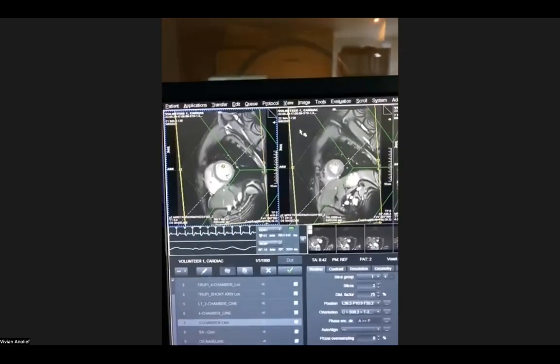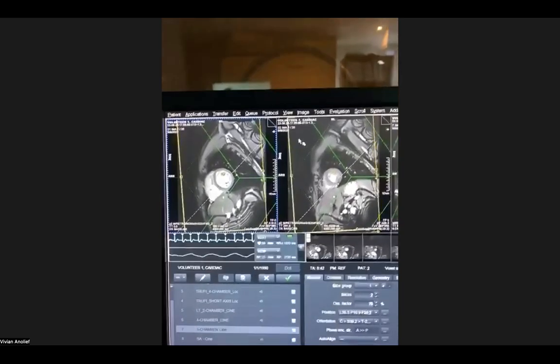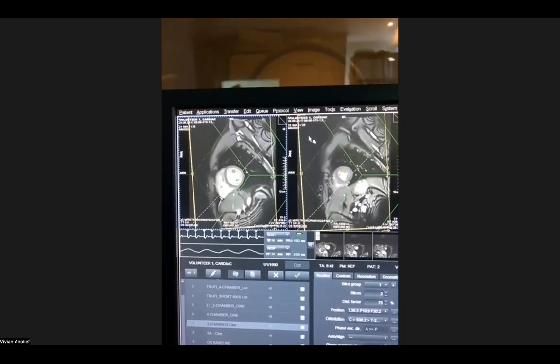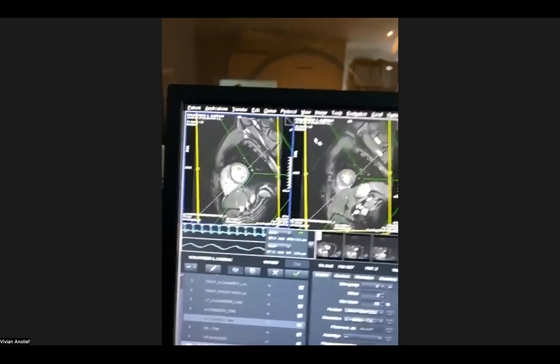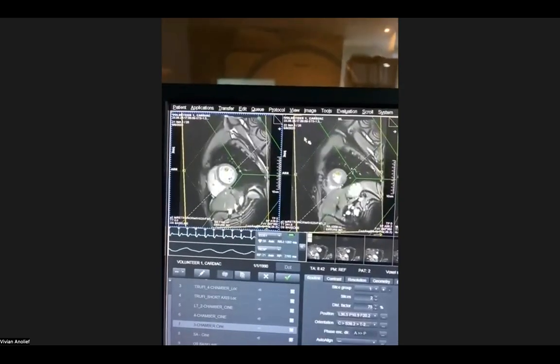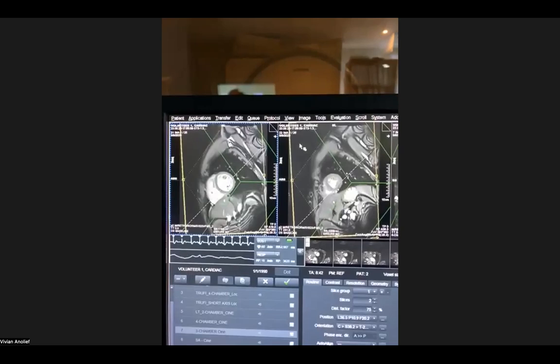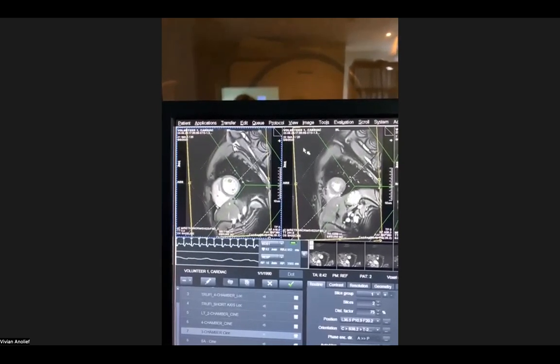Katerina, can I throw in something before you continue? You just have to make the patient know that it's not as long as you can, but at least 40 seconds. Yeah, so the patient has to be aware it's not as long as you can, but at least 40 seconds. Okay, so Joseph, can you hear me now? Okay, so the part where you have to hold your breath, please hold it for at least 40 seconds. Thank you so much.